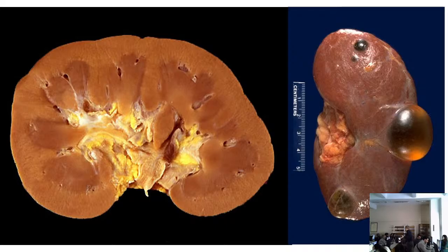So what do we look for by imaging? We look whether the wall of the cyst is thin, and we do not want the architecture to be complex. That means no septa dividing the interior of the cyst, and a homogeneous content favors a benign lesion. This is the case here, because these are 3-4 simple cysts.